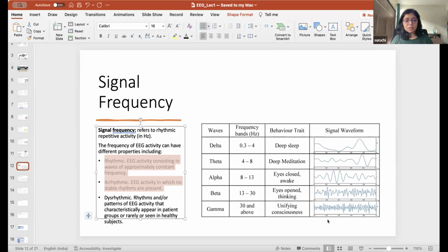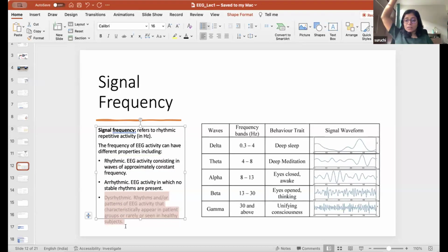But in those monks, you're getting confused with dysrhythmic. Dysrhythmic is spikes at different weird places in the brain. Let's forget about that, that is pathology. We're not talking about that. Actually, I was under the impression that high frequency means there is a problem, that it indicates an unhealthy state.